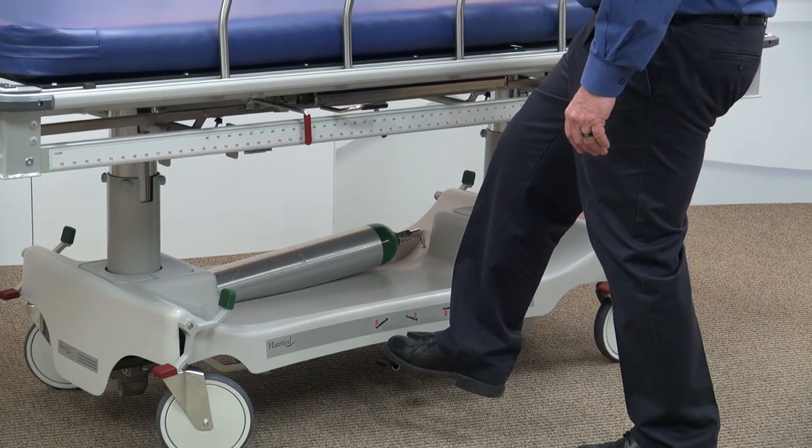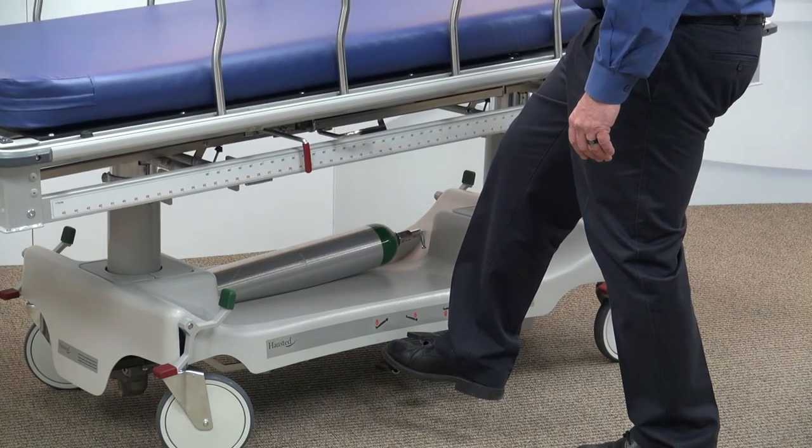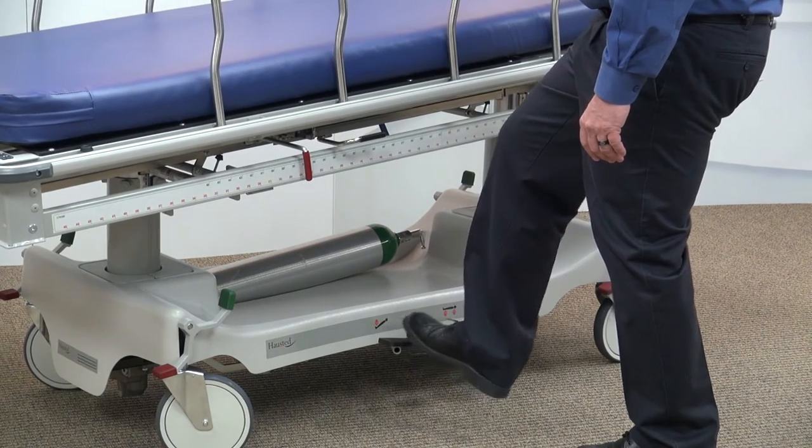Pressing on the center small pedal will allow the stretcher top to go into Trendelenburg, while pressing the left small pedal will position the stretcher into reverse Trendelenburg.